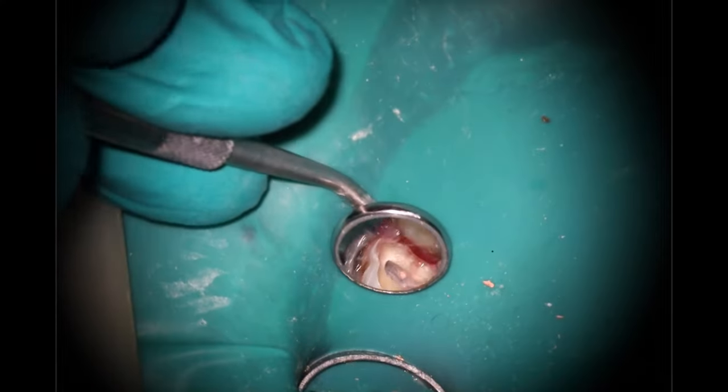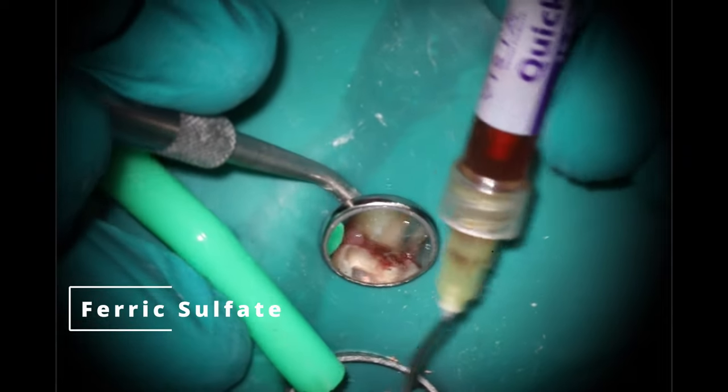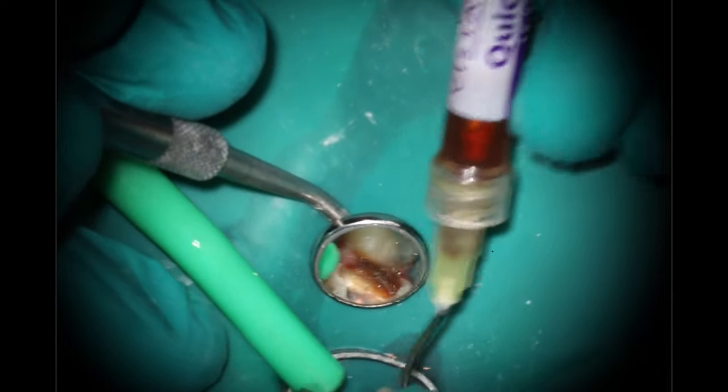First thing I'm going to do — the rubber dam was a little bit too close on that area, so I stretched it out over the tooth next to it. And we are going to start by dealing with that bleeding gingival tissue. Start off with the ferric sulfate to clean out the gums. My goal is to tamp it down as well as get the bleeding to stop.